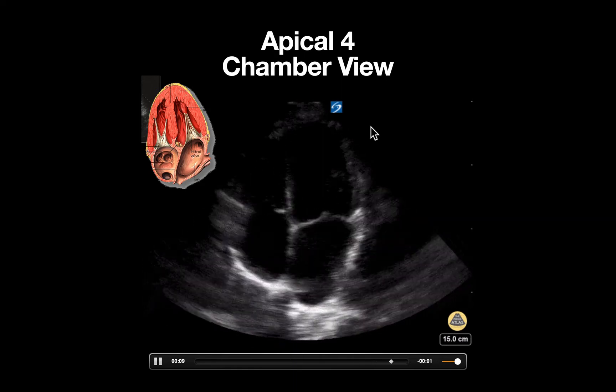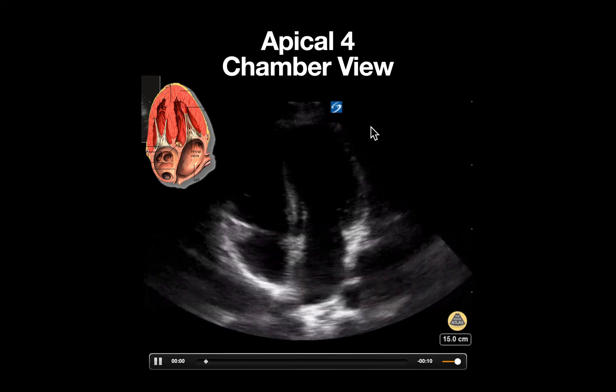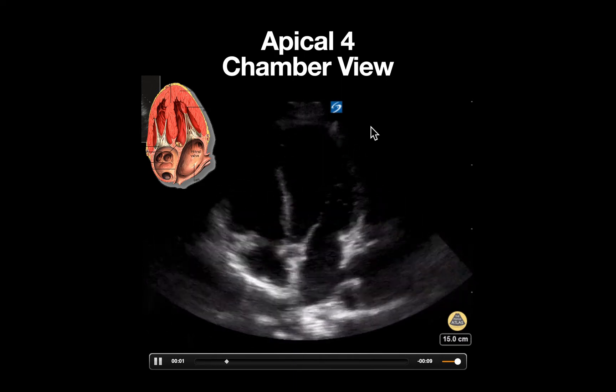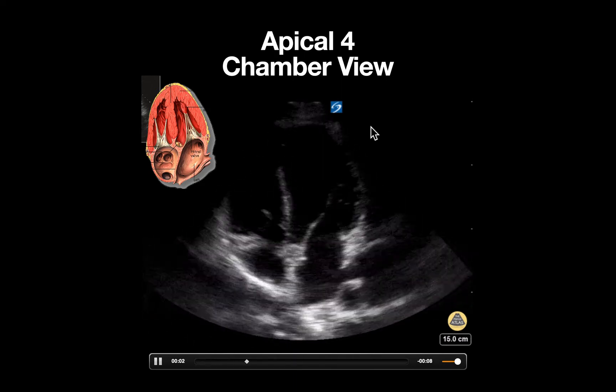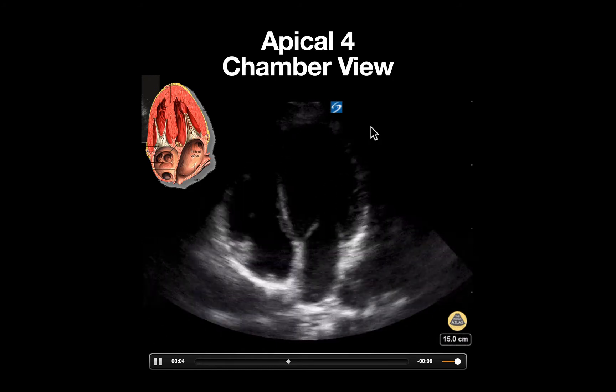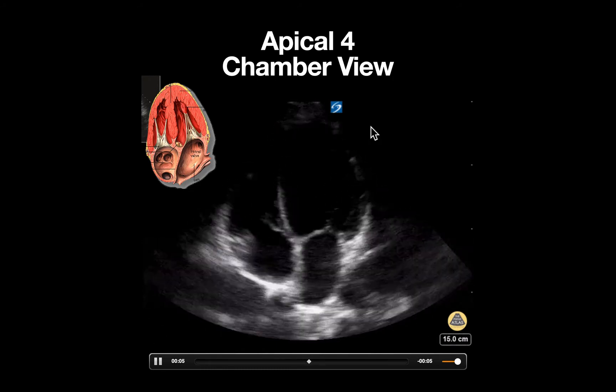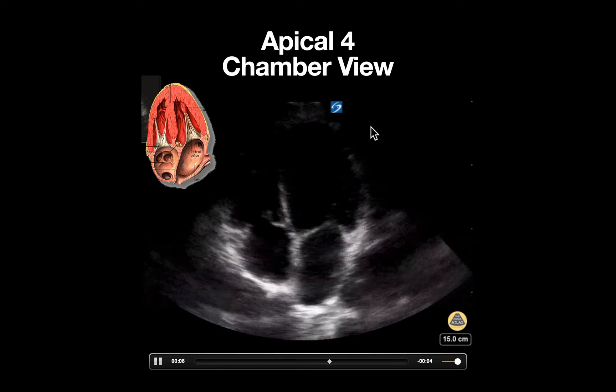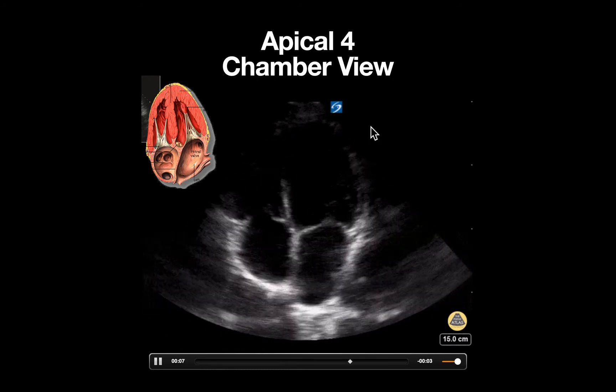The probe marker is pointed towards the patient's left axilla and the tail of the probe is dropped down towards the patient slowly until all four chambers come into view.